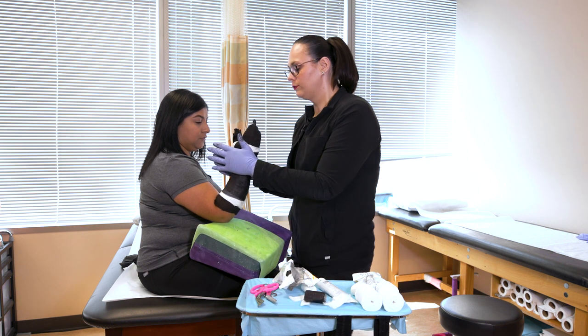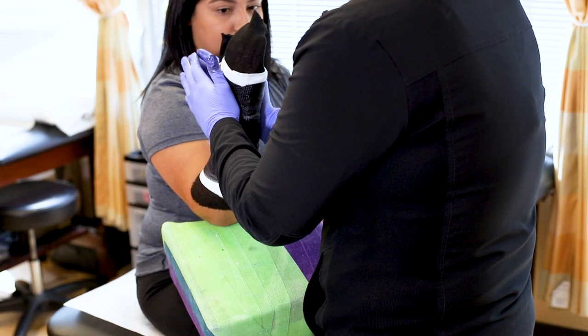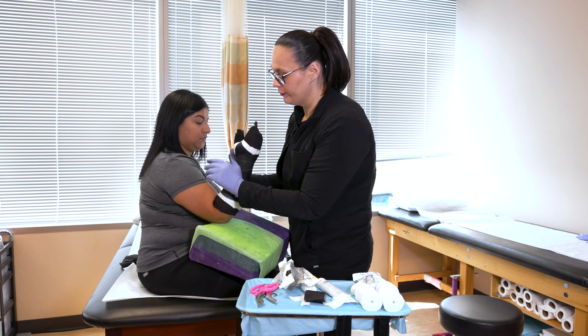We also have to get a mold, so you will feel a little bit of pressure. This mold is necessary to ensure that we're properly immobilizing your extremity where your injuries are, so as not to cause further injury.